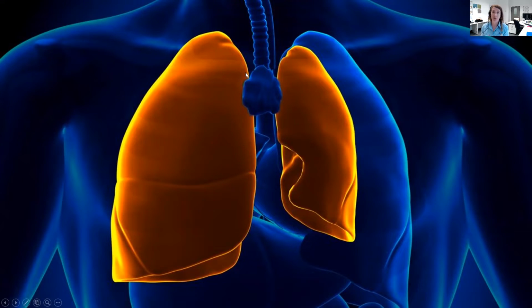So you can see this is, again, a very simple image. But if you imagine the patient's at the peak of inspiration, their lung should be nice and fully inflated, and this right lung is, but this left lung is actually quite collapsed. You can see here we still have the pleura on the outside, but we've got all this space here.